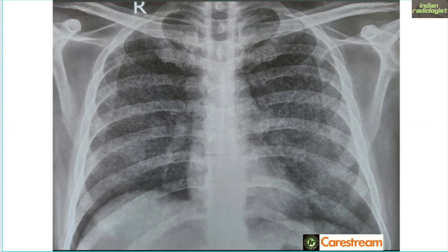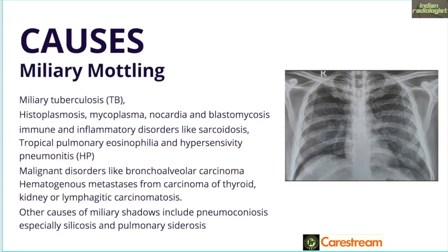This is the first X-ray — a chest X-ray of a child with fever. What we see here is multiple tiny nodules scattered across the lung. For those reporting in India, it is a very simple diagnosis: this is miliary mottling. The cause in our country especially is miliary tuberculosis, which is due to hematogenous spread. But there are other causes — sarcoid is a very close second, and hypersensitivity pneumonitis can also give rise to a picture such as this.